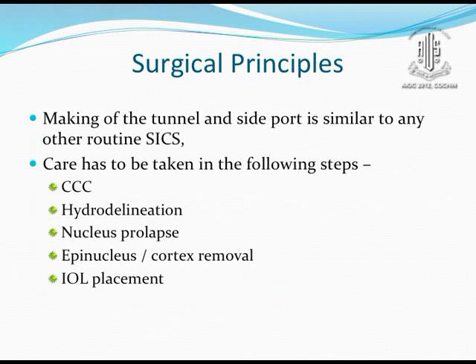Making of the tunnel and side port is similar to routine cataract cases. Care has to be taken in the following steps: rhexis, hydrodelineation, nucleus prolapse, epinucleus and cortex removal, and IOL placement.